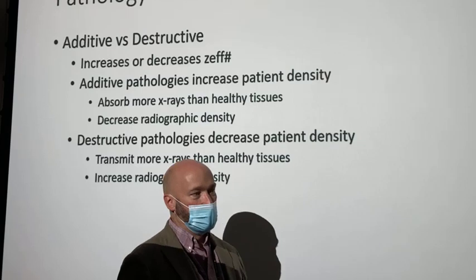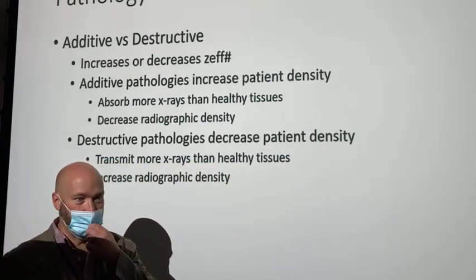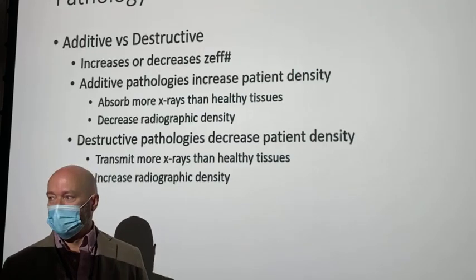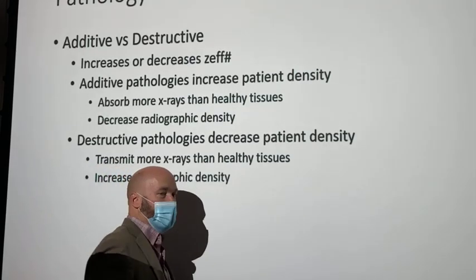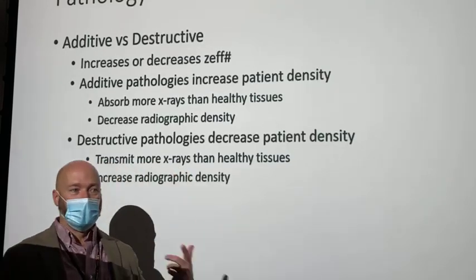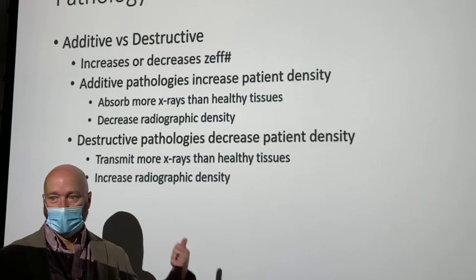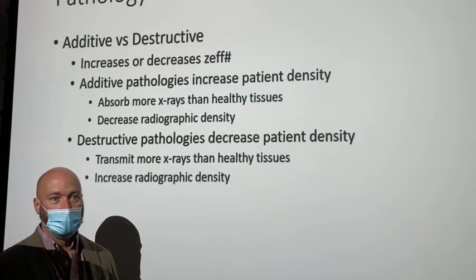So this lady lost her arm. She hadn't been able to use it. It had fundamentally no function, right? We do a chest x-ray on her, and the PA is not a problem, but we have to get a lateral. Because she hadn't used that arm, she lost flexibility in it. She couldn't move it either. So we just had to shoot a lateral chest x-ray with her arm hanging down.